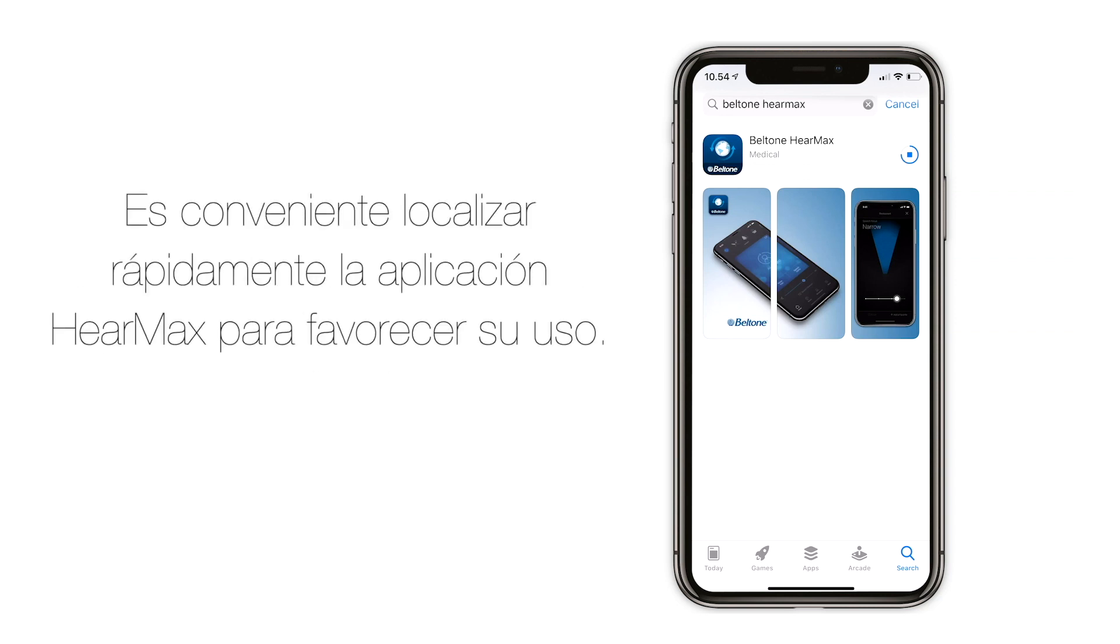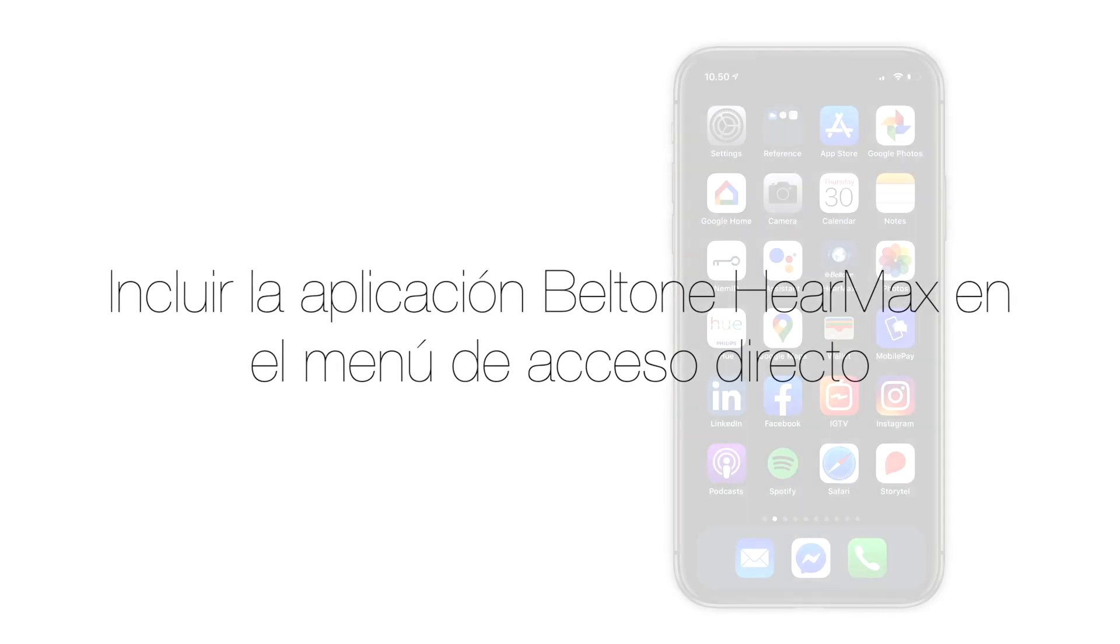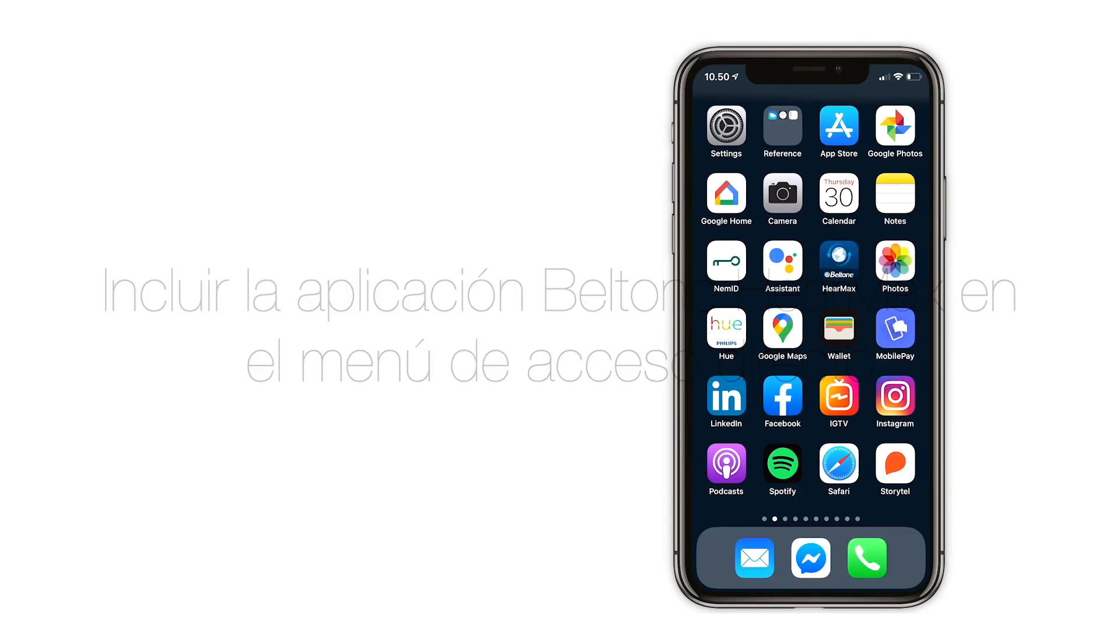It's easier to use your HearMax app if you can find it fast. A good tip is to place the app in your shortcut menu.